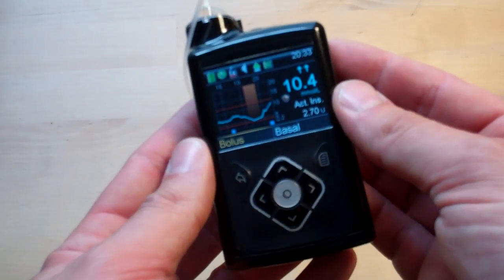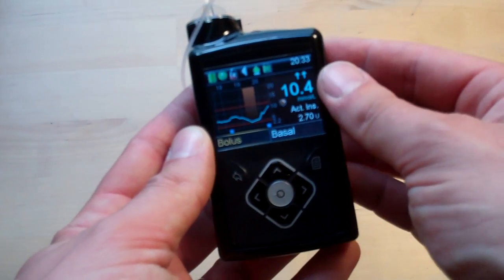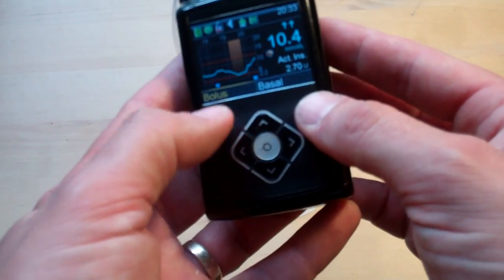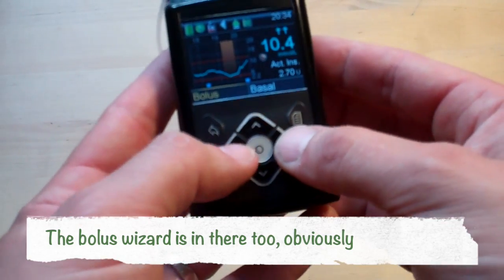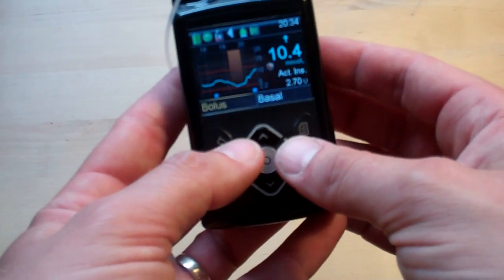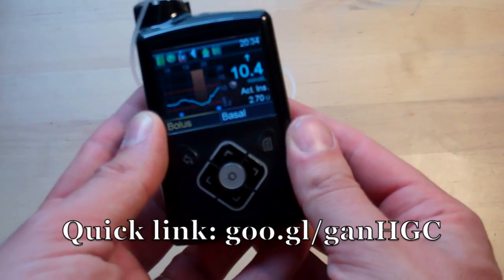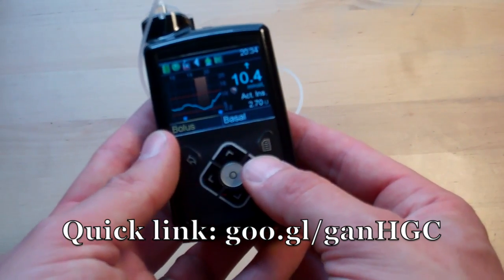Volume levels are much improved on the 640G — you really can crank it up. I took them up to quite high levels early on and actually had to bring them back down because it was quite piercing. If you're running sensors, up here you'll get the calibration icon showing when your next calibration is due, and then how many days are left on the sensor. At the bottom are the two main things you'll want: bolus for manual bolusing, and setting temp basals and other things. I'll put a link so you can have a good look online at the layout of the menus.